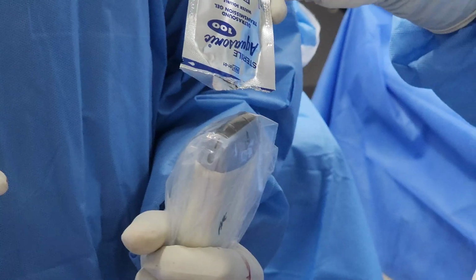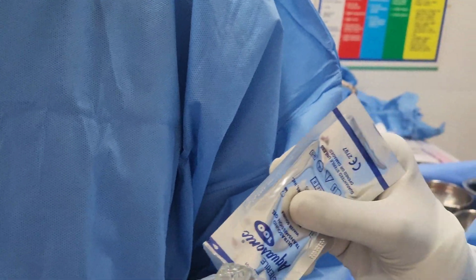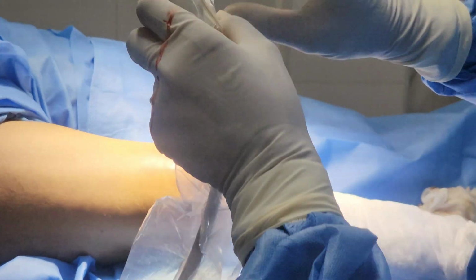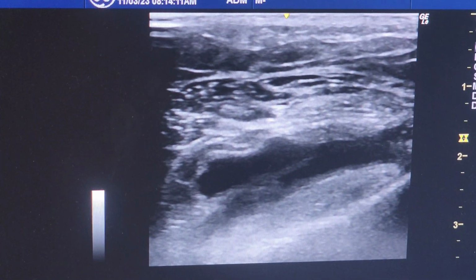So now I'm going to take some gel over the probe. This is sterile gel. So the whole procedure is done under aseptic precautions. So this is the side of the probe, which is to the outside, and I am now bending the knee and placing the probe. So you see that black area?